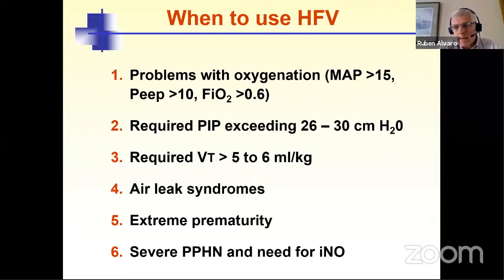So again, these are my biases in terms of what we use here in Winnipeg to switch a baby, or to consider switching a baby, from conventional to high frequency. But again, it depends a lot on how comfortable you are using high frequency. Because if you have never used high frequency ventilation, I would say just keep working on the conventional a bit longer, okay? Until you get familiar with how to use the high frequency, and then you can start using more conservative parameters to switch a baby sooner, okay?